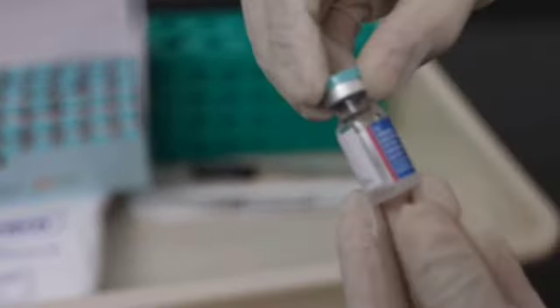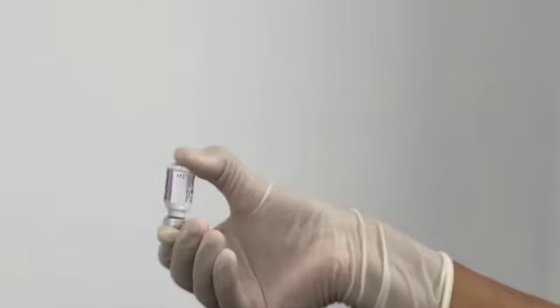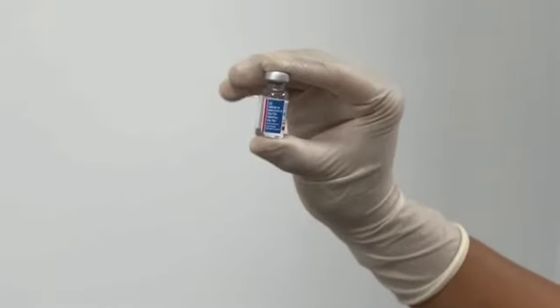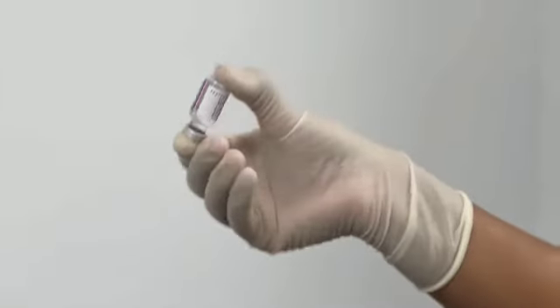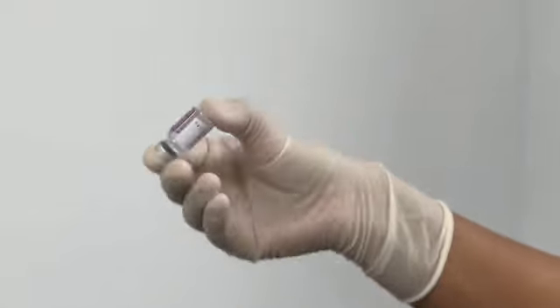Check the vial visually. Vial should be free from particles or aggregates. Mix by inverting 2 to 3 times. Mixing should be performed gently. The test may only be administered if the solution appears as clear and colorless to pale yellow.